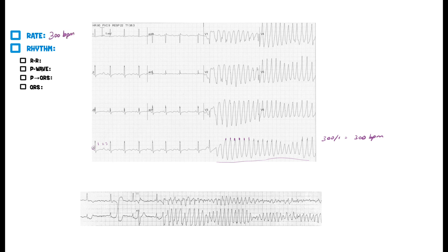This arrhythmia is going super fast — 300 beats per minute. That's the first thing. Second thing: R-to-R interval — is it the same? Starting from this point here: one box, one box, one box, one box, consistently about one box. That's 300 beats per minute consistently. The amplitude might differ a little because it's kind of twisting around the baseline — which is a key word for this one called torsades.